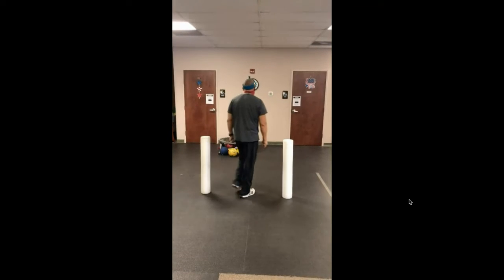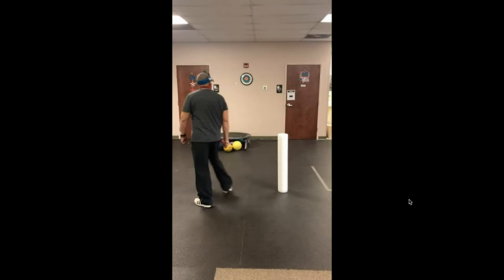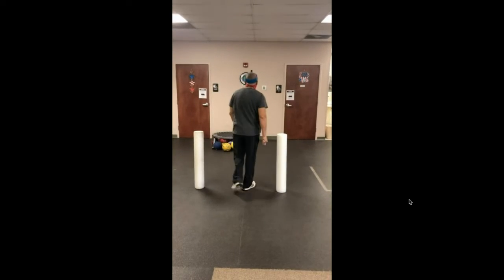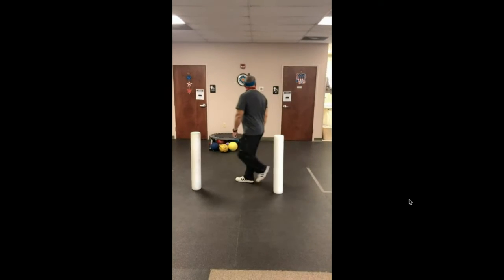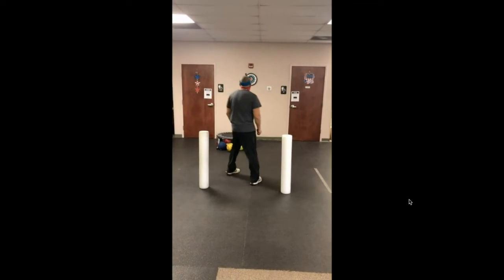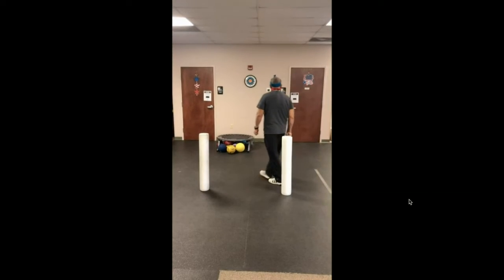And so once we stop him, we go, okay, go ahead and go the opposite way for me. All right. As he starts to back up, he doesn't like that change in direction. He kind of came off the target there a little bit, really drops down there. You can see that full excursion. He wants to put his hand out because he doesn't know where that is compared to when he's moving around the other side.